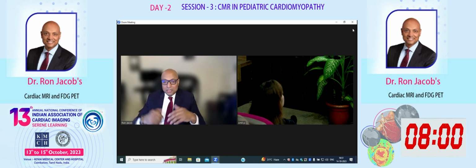Tying that in with therapeutic decision making is really where it's at, and we have to have enough diagnostic confidence in the numbers to say we're going to stop your immunosuppressive, or we're going to escalate it and give you something that's potentially a little more harmful but may be beneficial.